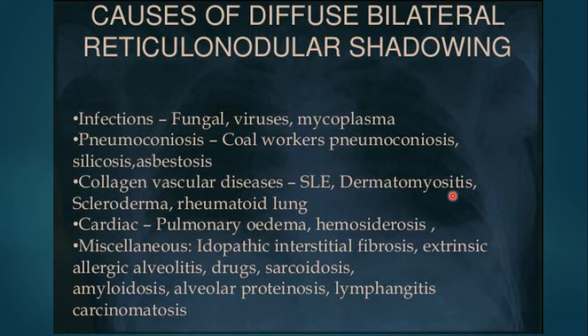narrow our differential diagnosis. Okay, so you just see a reticulonodular pattern and we write all this differential. This is totally wrong. We need to see everything in order to narrow our differential diagnosis to the least possible. And we need to know every radiological appearance of every one of them, or at least the common ones.